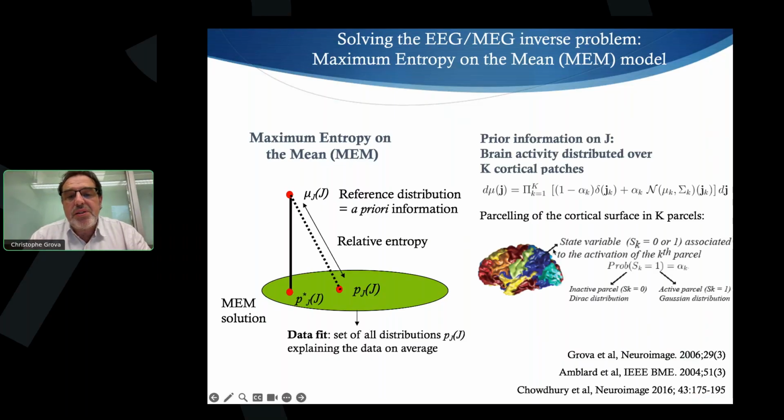The only thing that I think is interesting in MEM is the fact that our prior is a parcellation of the brain. So we consider the brain to be organized in K parcels, and those parcels might be active or not. So the method is able to switch off parcels, and when the parcel is on, we have a Gaussian prior, which is a kind of Loretta prior: minimum norm plus some local smoothness. I will also mention that the number of parcels is usually roughly the number of channels of our data, so around 100, 200. But it's not a tricky part. Whatever the parcellation is, the solution will be quite stable.